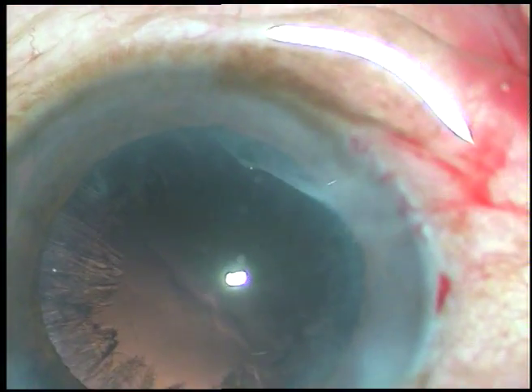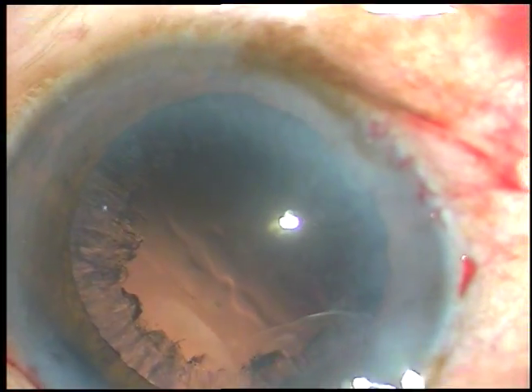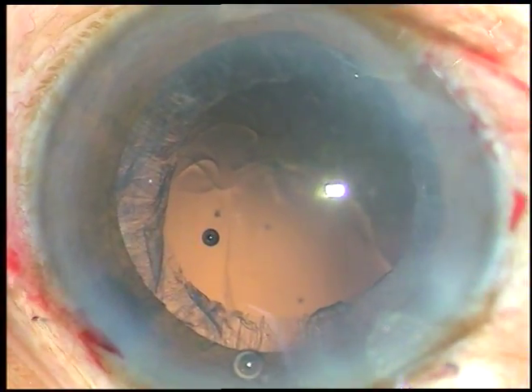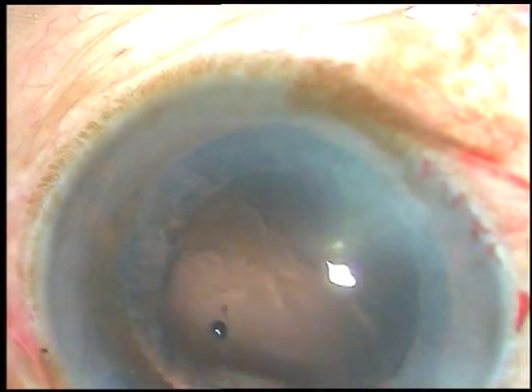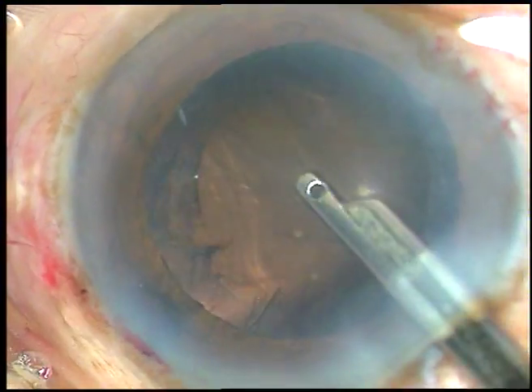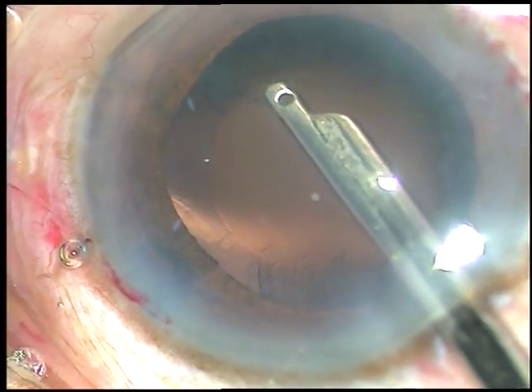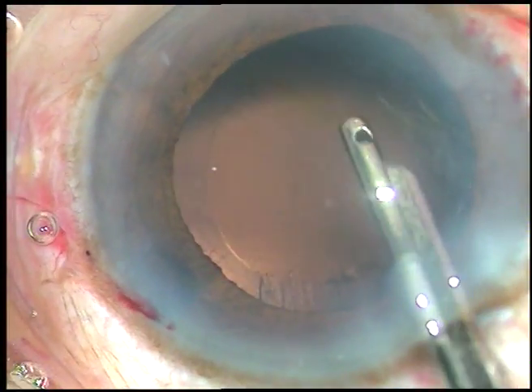Nucleus is managed and now viscoelastic substance is injected. If you inject viscoelastic substance, the anterior chamber remains formed for quite some time. Using Simco through the main wound, the visco is coming out gradually and the anterior chamber is remaining very deep for removal of the viscoelastic and removal of the cortical matter.